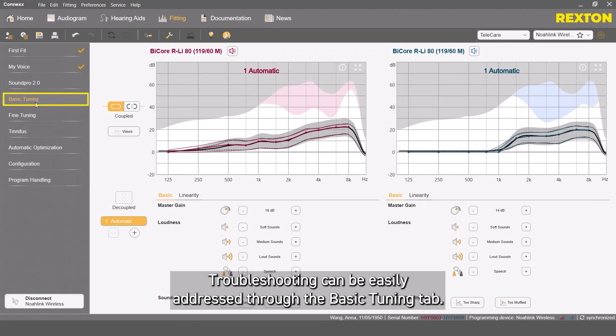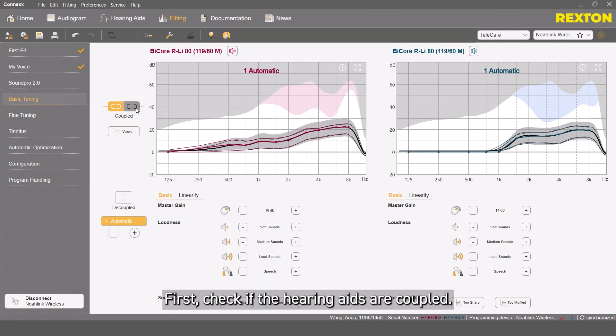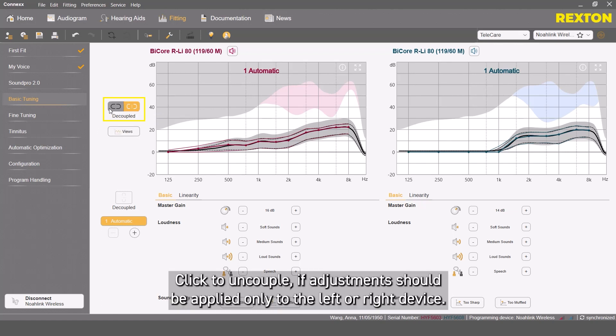Troubleshooting can be easily addressed through the basic tuning tab. First, check if the hearing aids are coupled. Click uncouple if adjustments should be applied only to the left or right device.